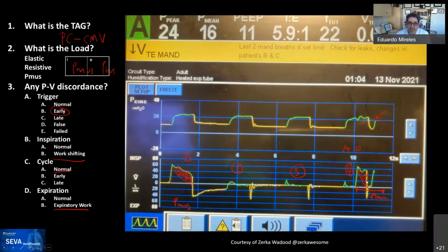So good question, Ryan. If I had a patient like this and you're trying to ventilate him, this may be as good as it gets. You set a rate, or you put him on pressure support and hope that you set an alarm for a minimum minute ventilation and be sure that he's getting it, while the evident injury to the brain resolves. Those are things that I can think of. Any other comments, questions, disagreements, anger management?